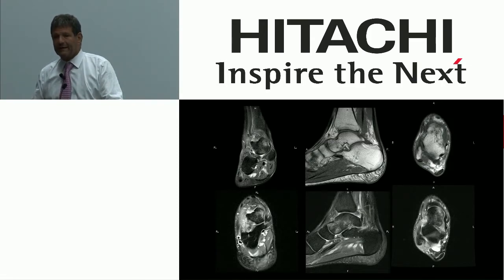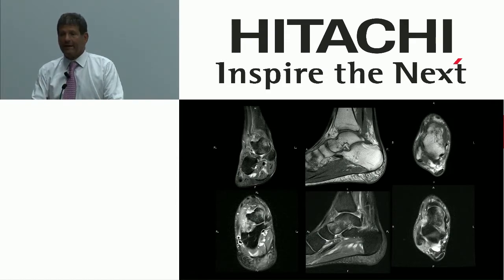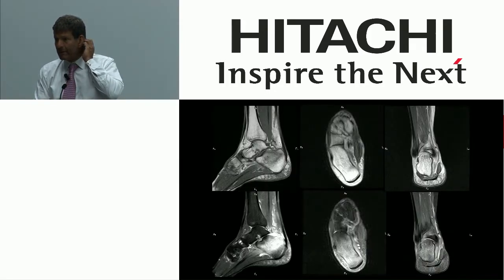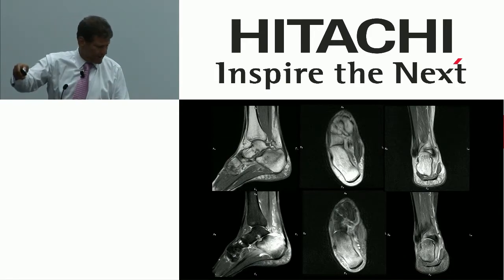These are 30-minute exams, on and off the table in 30 minutes. Open magnet, on and off the table, 30 minutes. The scan times that you will see here run somewhere in the vicinity of 15 minutes. Okay, this is what we're after.